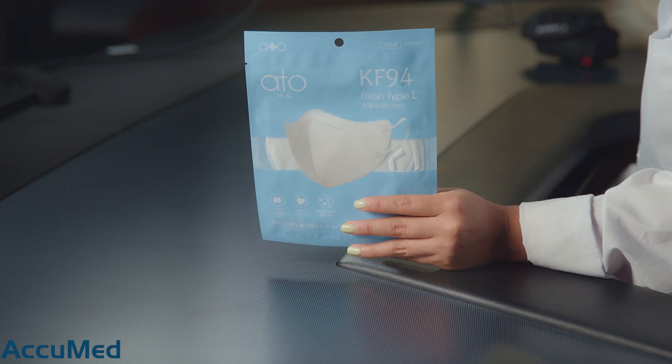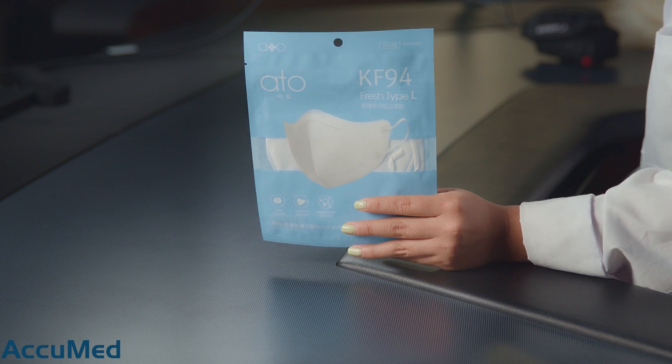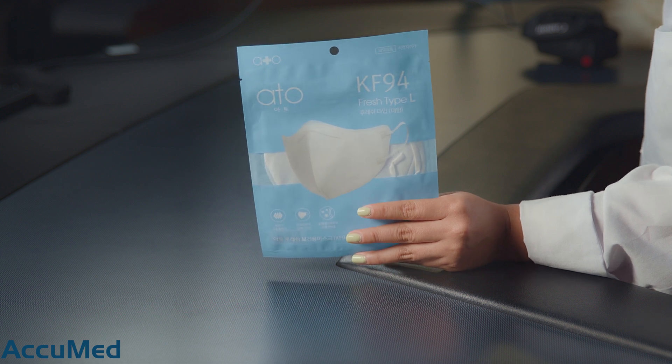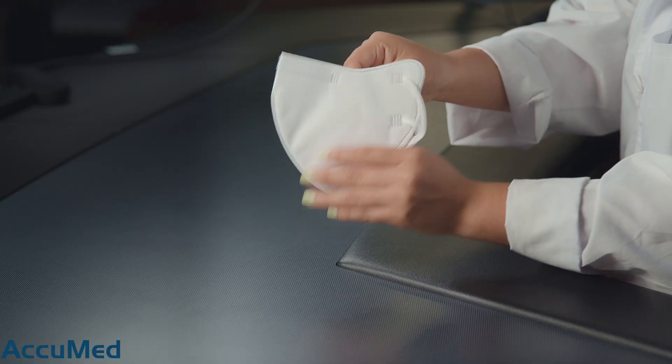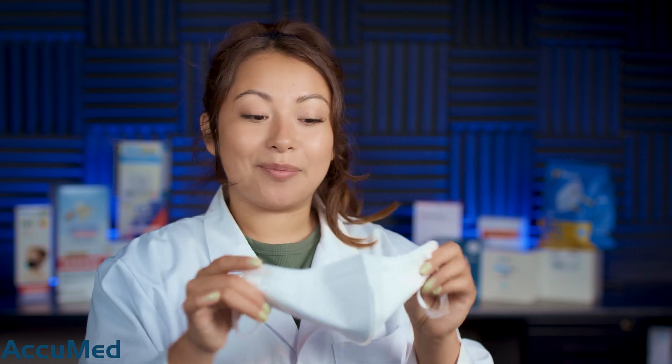These are KF94s, which is a Korean standard, but these are not a trifold style as we typically see with KF94s — these are more of a bifold style. These are actually very thin, but don't let that fool you, because typically KF94s test between 98% and 99% filtration efficiency. They may not have the best construction feeling at first glance, but we're going to see how these test on our TSI machine.